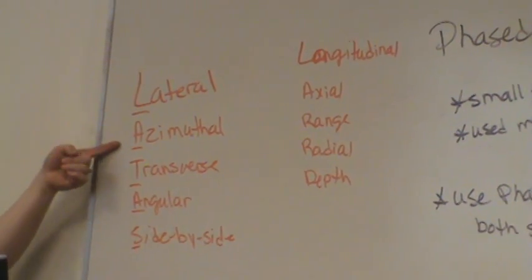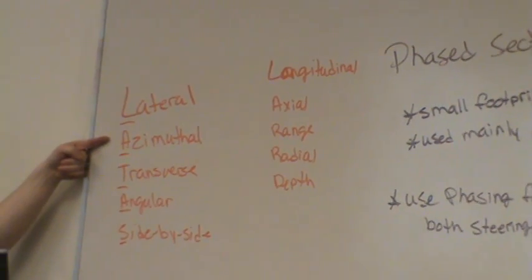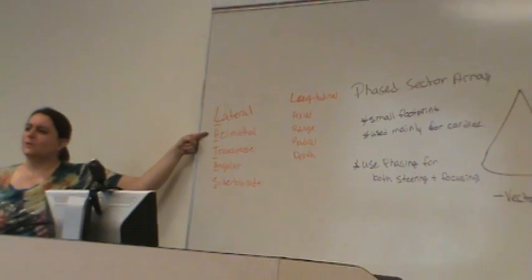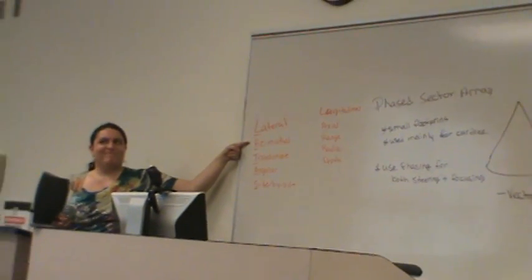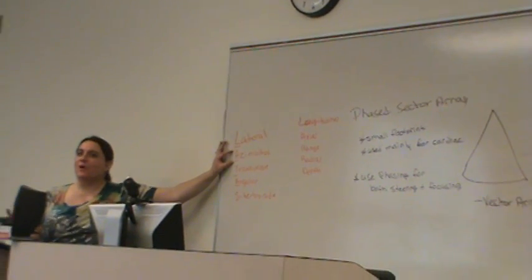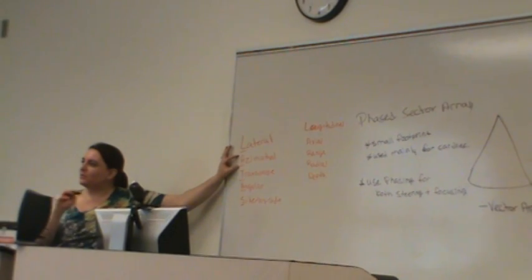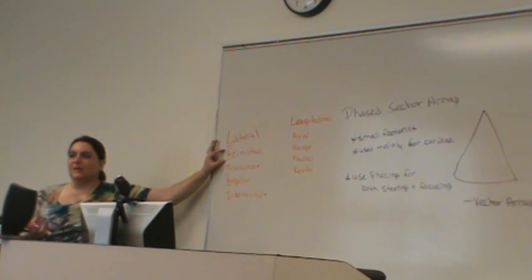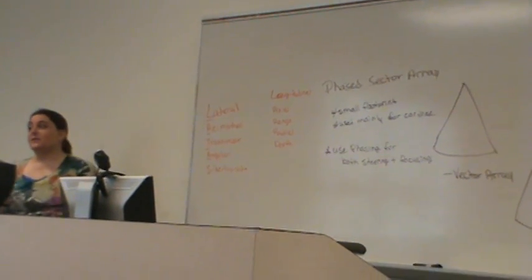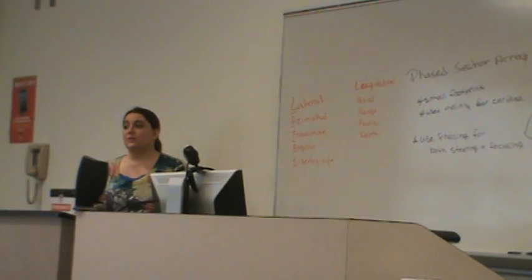Transverse sometimes, but azimuthal, I don't hear a sonographer, for the most part, talking in everyday language and saying, hey, my azimuthal resolution was poor today. You know, it's not something I hear. I think it came more from the academic side of things. If you were in a more academic setting, they might use that term more. But like I said, on that test, they're going to put those words on there that maybe are the ones that we didn't use every day in class.